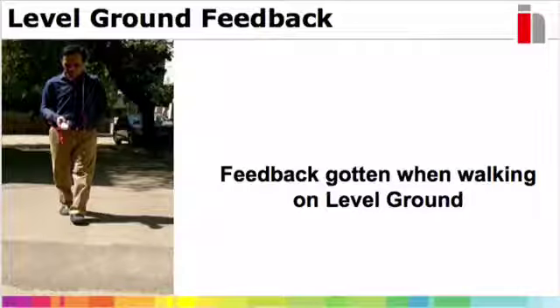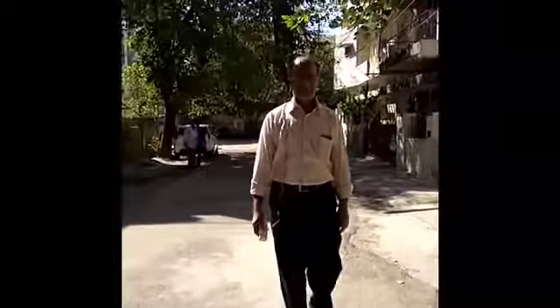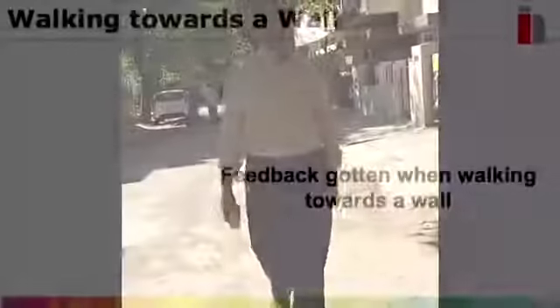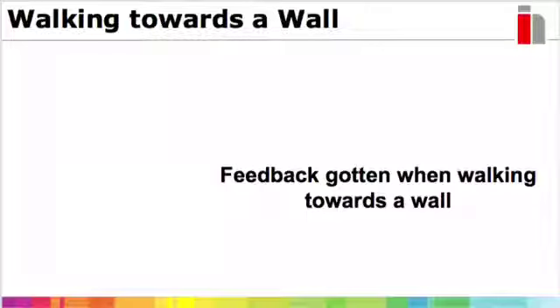When walking on level ground, you get this kind of feedback. When you're getting close to a wall, you will hear this pattern.